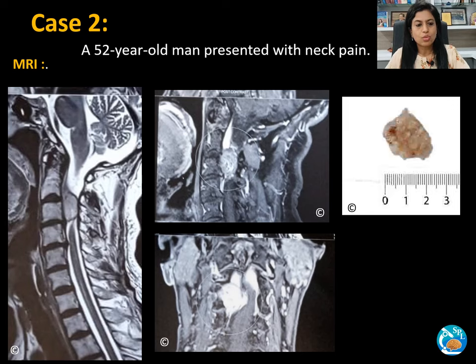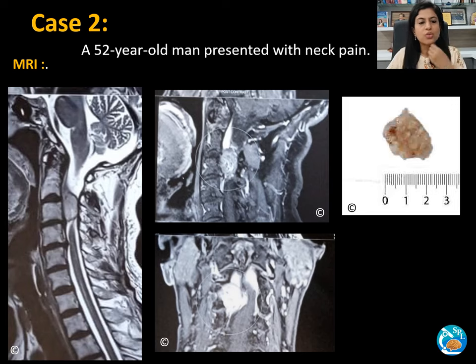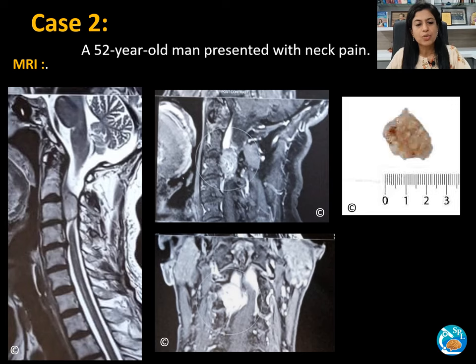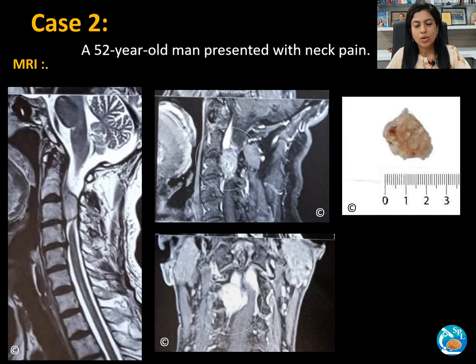Case two: a 52-year-old man presented with neck pain. MRI revealed a lobulated well-defined intra- as well as extradural soft tissue mass in the right C2-C3 neural foramen with right paraspinal extension, measuring approximately 3.9 × 1.3 × 2.9 centimeters with large extension into the spinal canal. The lesion is well-encapsulated and shows heterogeneous hyperintense signal on T2-weighted images and isointense signal on T1-weighted images.